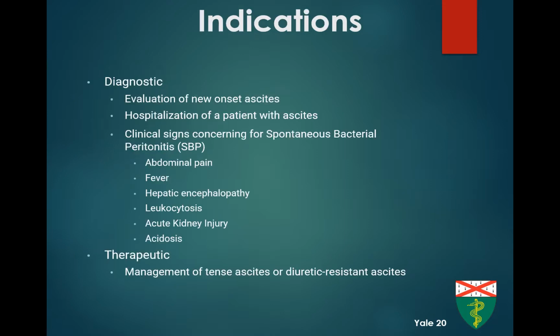The indications for a diagnostic paracentesis include evaluation of new onset ascites, hospitalization, and clinical signs concerning for spontaneous bacterial peritonitis. A therapeutic paracentesis is helpful in the management of diuretic-resistant or tense ascites.